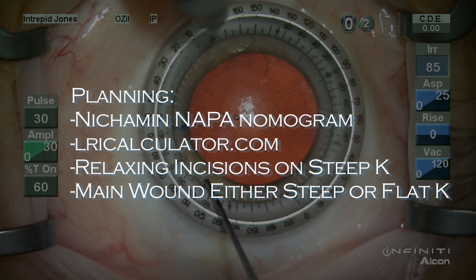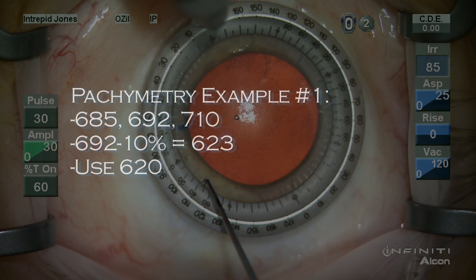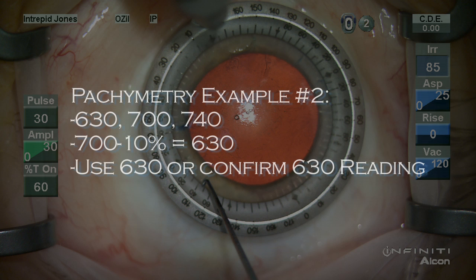My relaxing incision is placed on the steep K and the main wound on the flat or steep meridian. Pachymetry is important and I use a DGH or MMD device which will measure peripheral readings well — I get three readings over the intended arc. In this case, a middle reading of 692 minus 10% gives us 623, so I'm going to use 620. In another example, 10% off the 700 middle value gives 630, so I'll use or confirm the 630 reading.